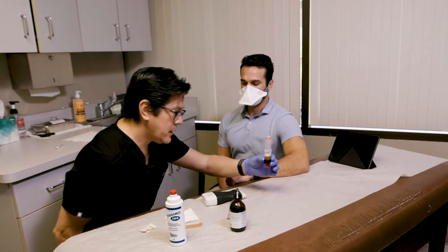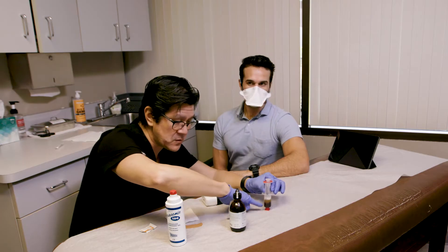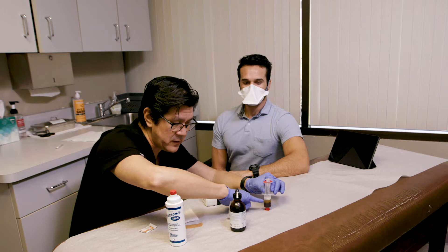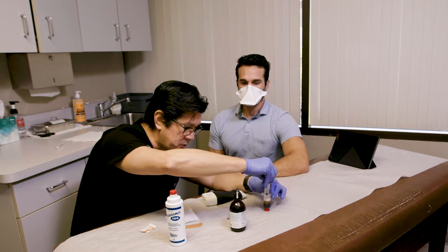So this is the PRP. It's now been centrifuged, and what we're looking at is below — the red cells and white cells. The red cells are here, the white cells are close to the center area, and up above, this yellow is the plasma — the platelets and growth factors. We're going to take this off and titrate that out.